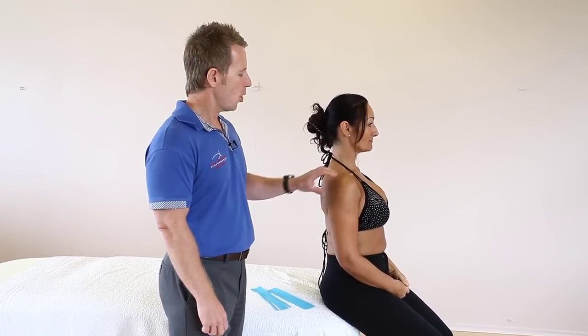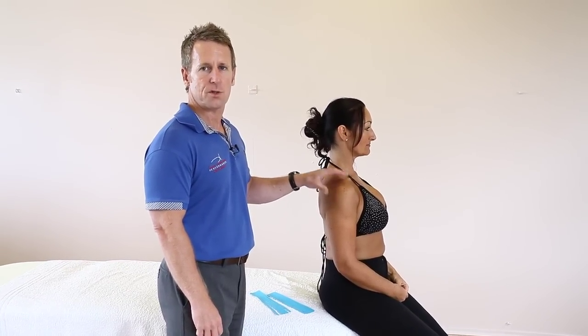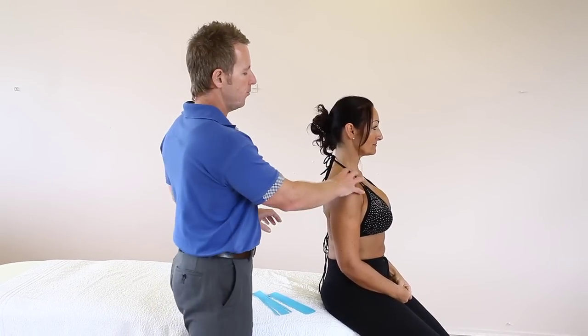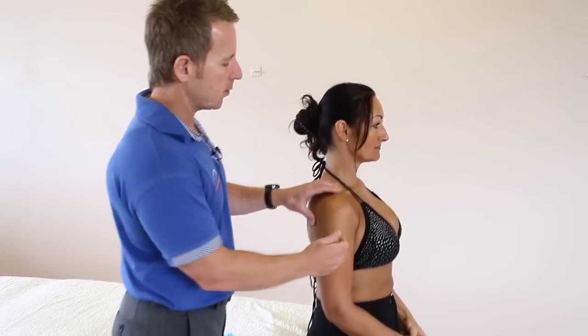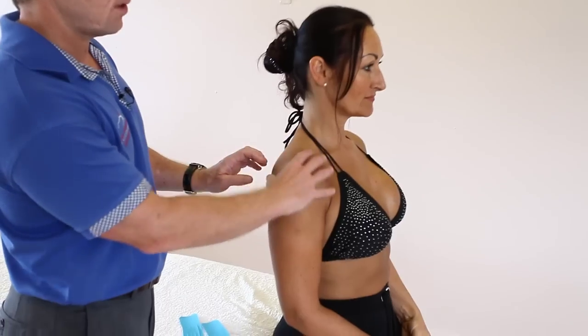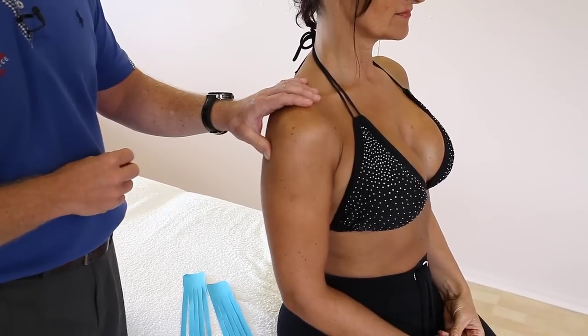Next we're going to be taping the shoulder and we're going to be looking at lymphedema. So if the patient has any form of swelling or bruising through trauma around this sort of area, rather than being specific to one point like the supra or the bursa, this is sort of generalised shoulder pain and you might notice some swelling but you would definitely notice some bruising.